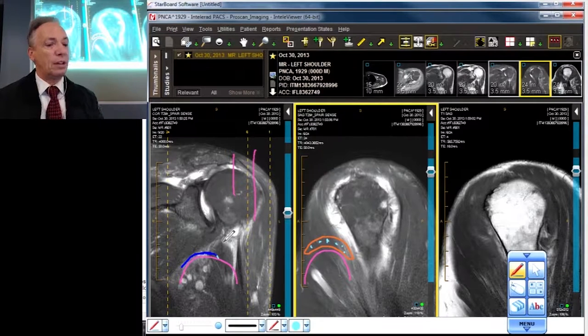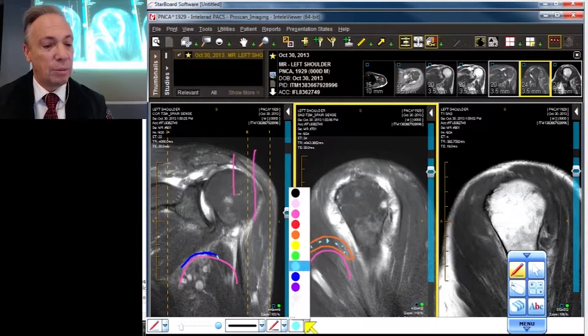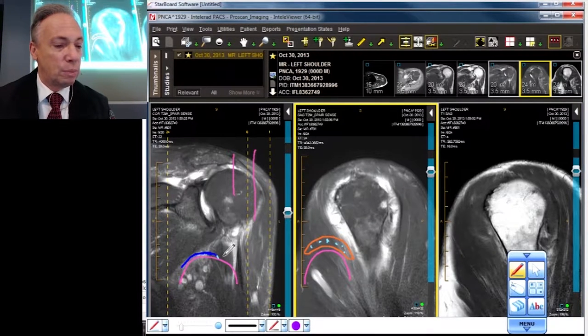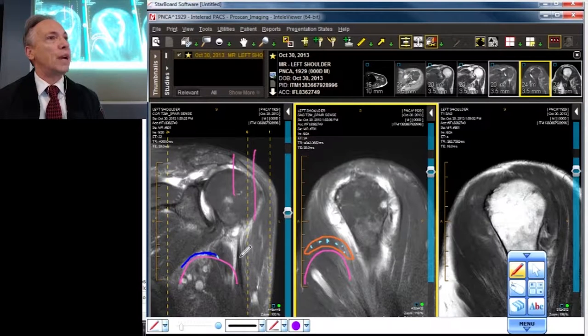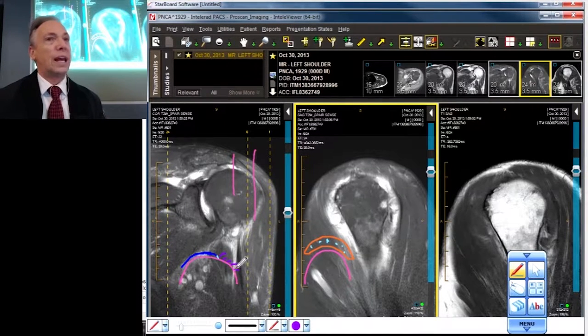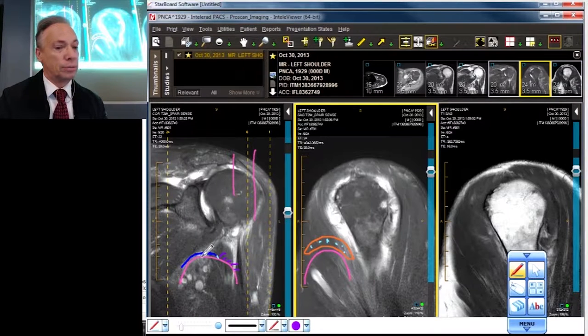That lighter signal signifies that you're making the leap or transition to the infraspinatus, even though we all know there's quite a bit of interweaving and interdigitation between the fibers of these two structures. The infraspinatus, which I'll make in purple, has a steeper radius of curvature and often looks a little more like little hairs coming in, whereas the supraspinatus looks more like a flat black structure.